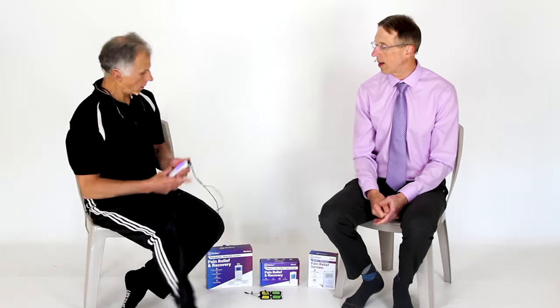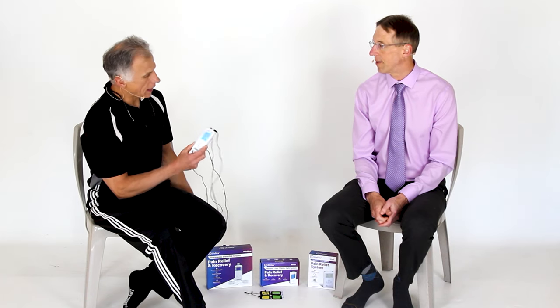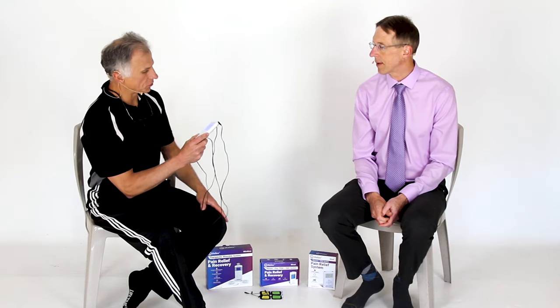Now Brad and I have tried dozens and dozens of TENS units — we've said this on other videos. All were good, all were powerful. Some of them didn't have very good instructions, and because of that we decided we're going to endorse iReliev. We've done videos on three of their units. We have the 1313; Brad has the 8080, which is probably our favorite and the most commonly purchased.